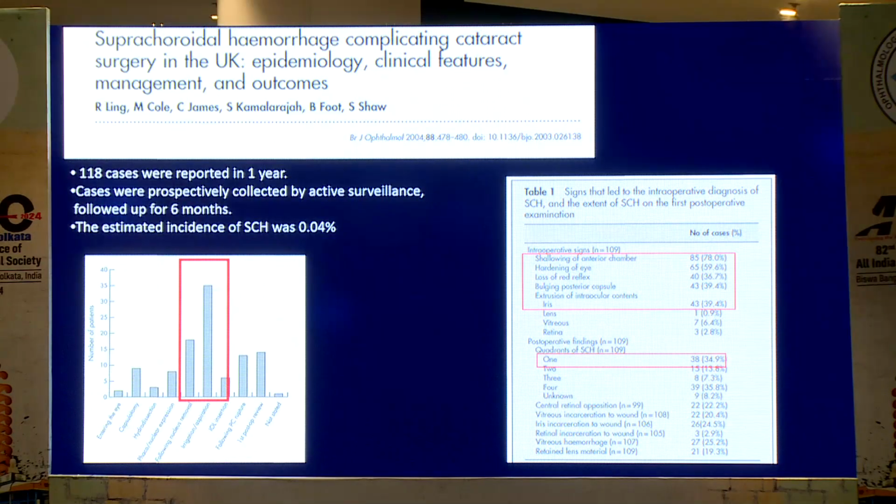and aphakic eyes. There is an interesting article in the British Journal which showed that most expulsives happen following nucleus removal when the globe is distorted. Hence it is important that we always keep the anterior chamber formed at any stage of phacoemulsification.